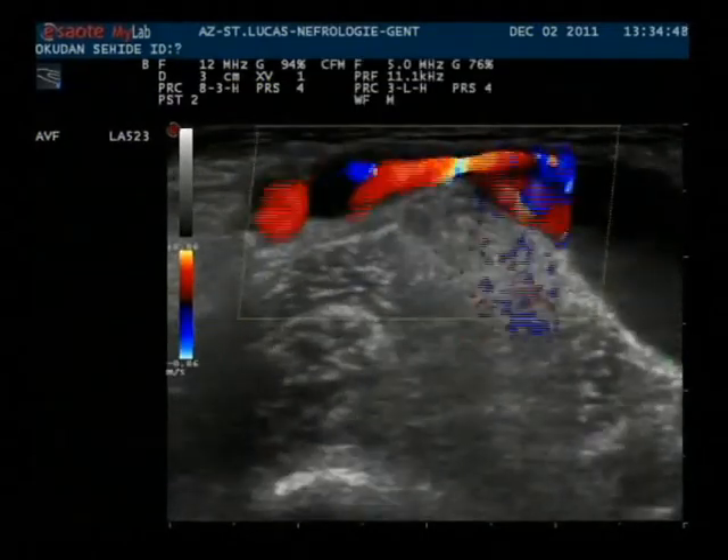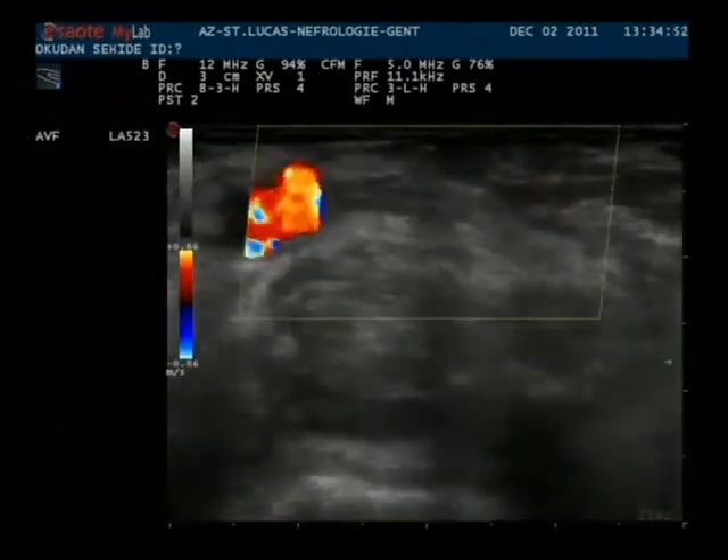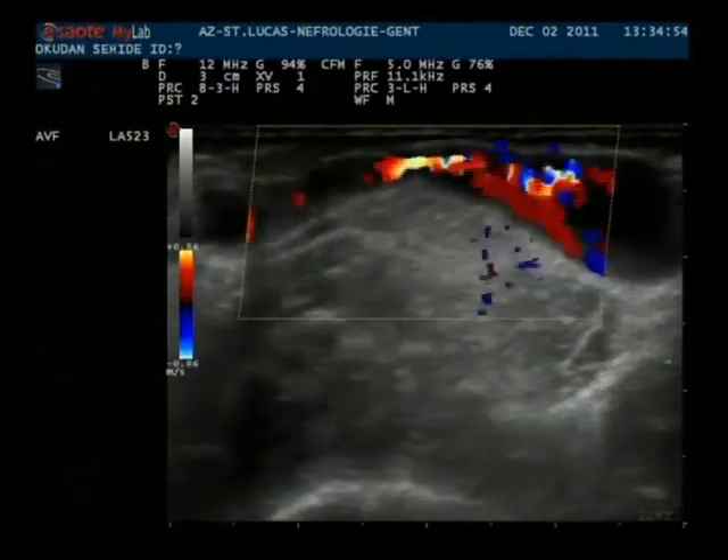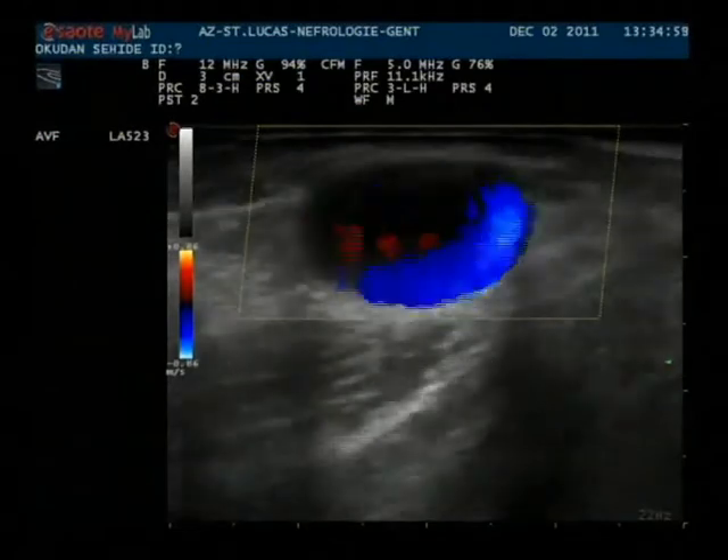In B-mode we can see that there is no significant stenosis. And now we will follow the outflow vein up the arm.